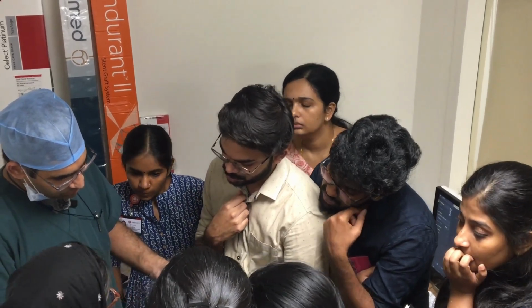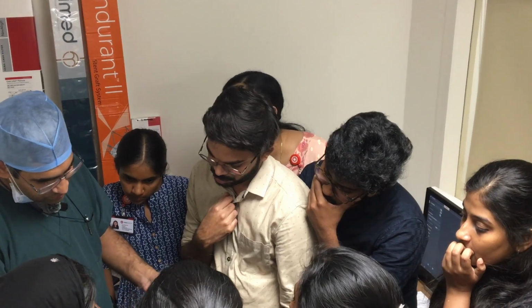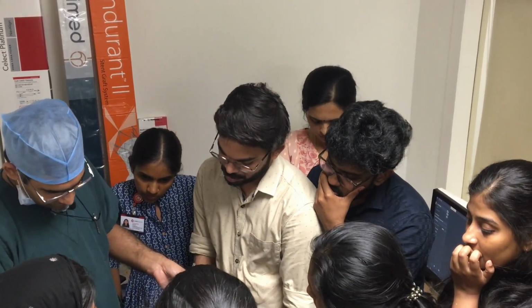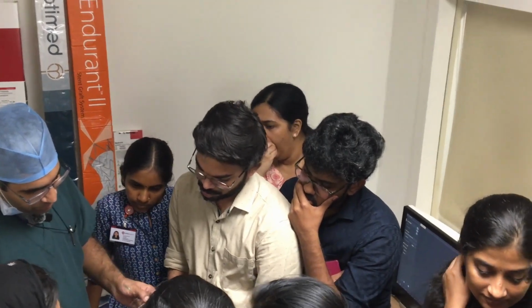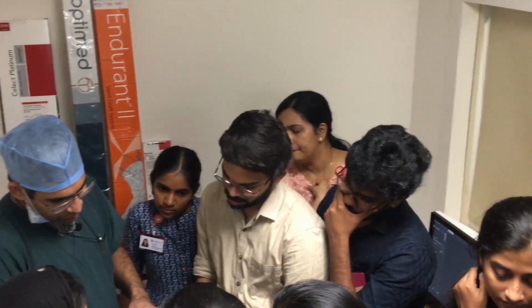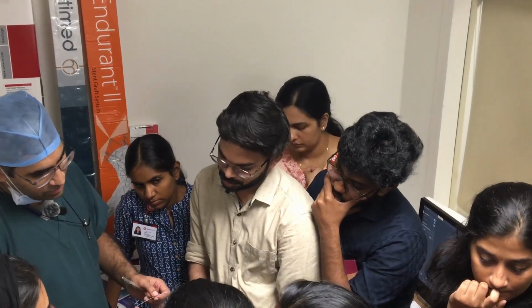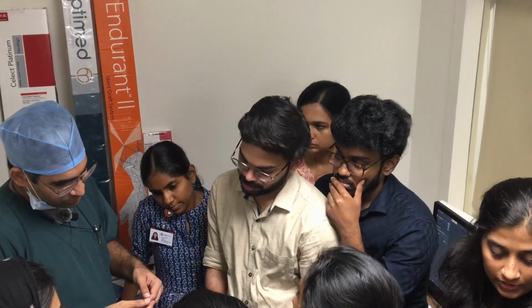Okay. This much is over the wire. This much is still flimsy. Okay. And then at the end there is a hardening stylet there. So up to here it's flimsy. So you need to have a guide catheter very close to the lesion to support all these things. Otherwise, pushability will not be there.